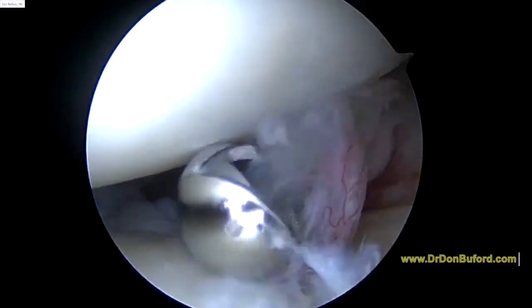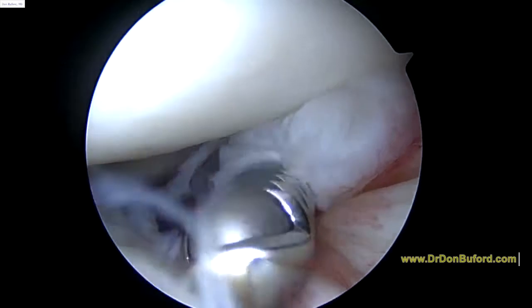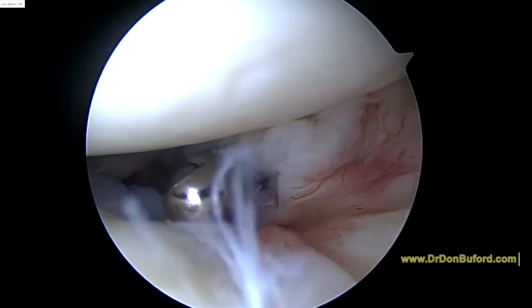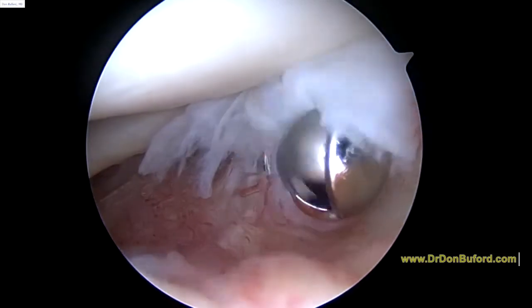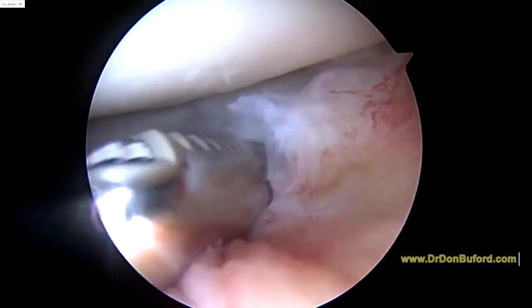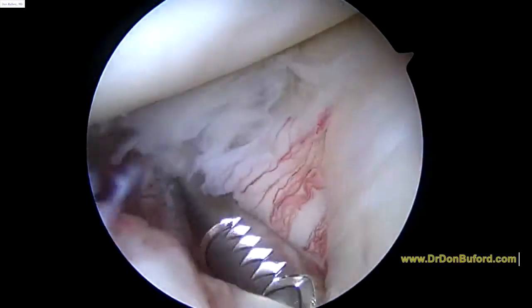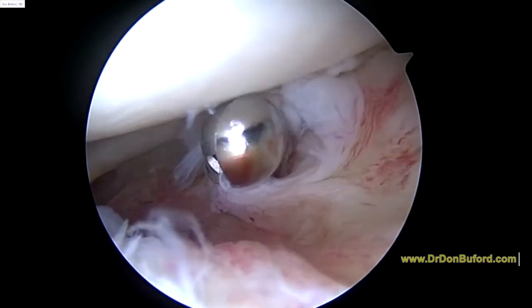So we're going to put the shaver in and see if we can identify what's going on here. It's hard to tell if that biceps has just recently ruptured or exactly where it is here, as you see. Normally the biceps should be all the way down to the joint here — we're just seeing this tissue here.